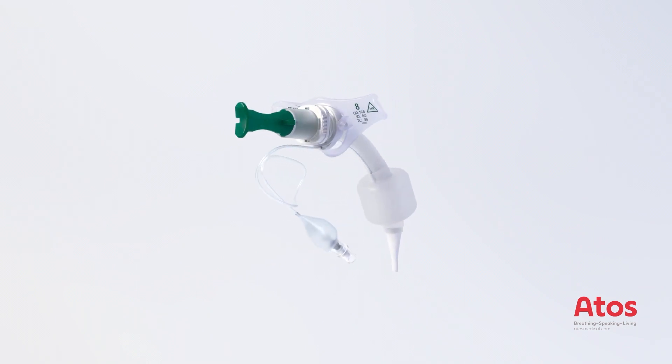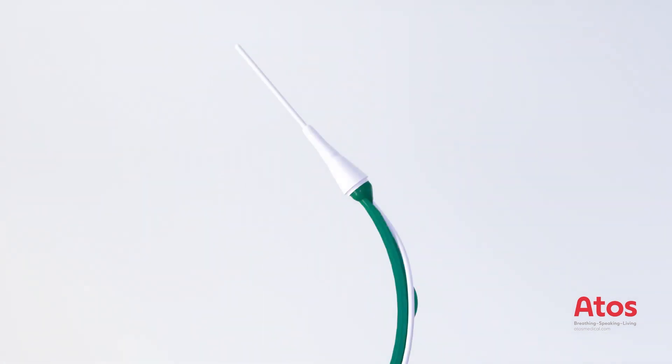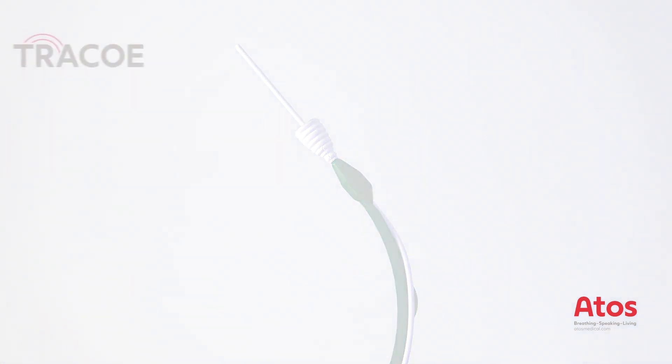The Traco Twist Plus P tubes are pre-mounted on a minimally traumatic insertion system. For the placement of the tube, a silicone sleeve compensates the gap in diameter between the inserter and the tube tip. The sleeve is attached at the guiding catheter.